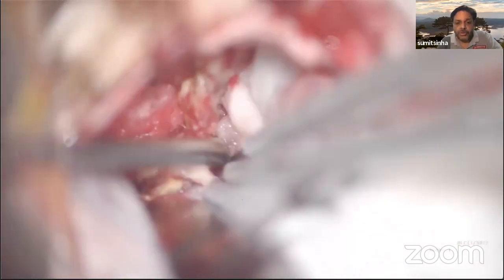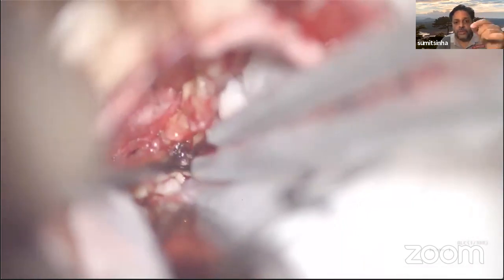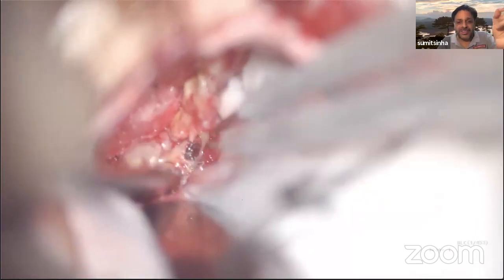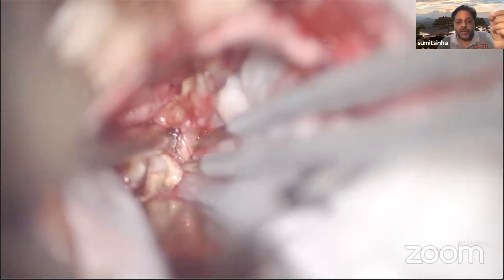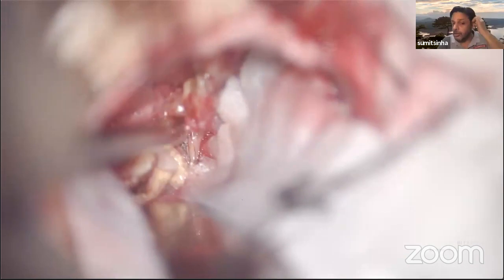Lifting up the tumor from the brainstem. This is a very crucial step. While you lift the tumor capsule from the brainstem, you have to ask your anesthetist about any changes in the hemodynamic stability, because sudden bradycardia can happen while you are lifting up the tumor capsule from the brainstem.